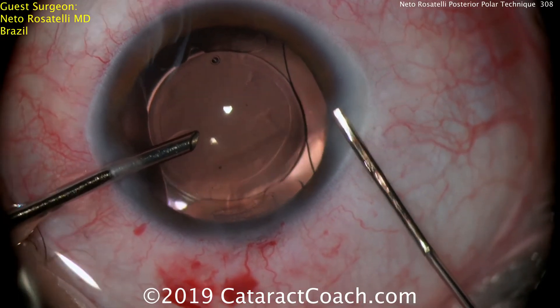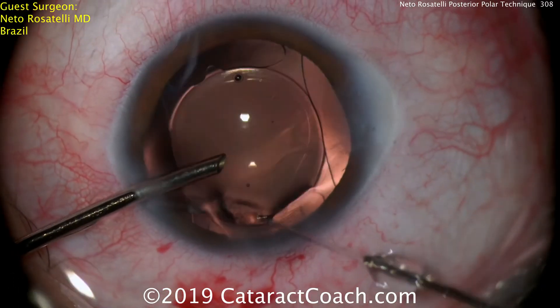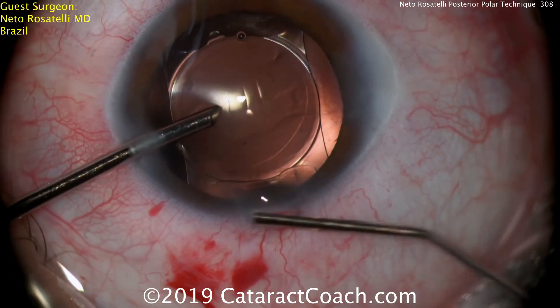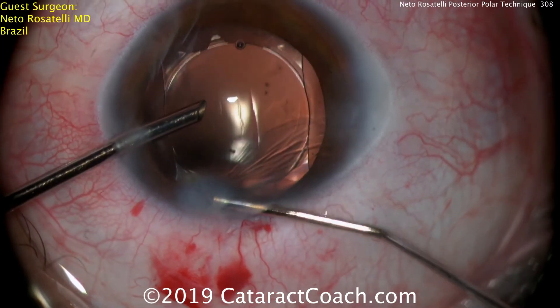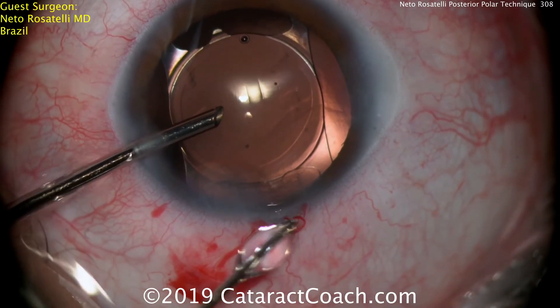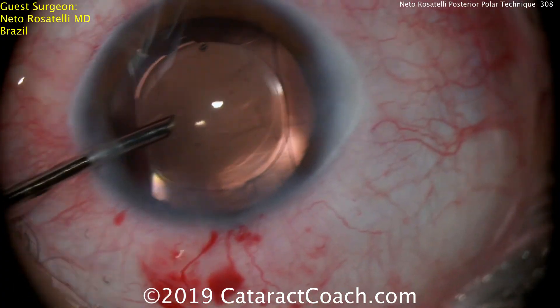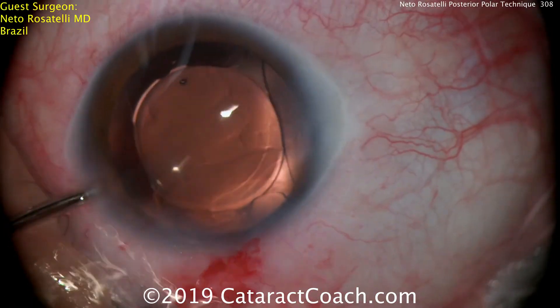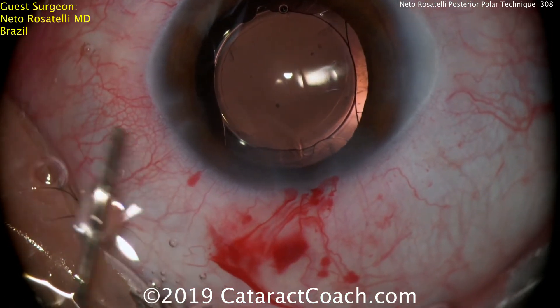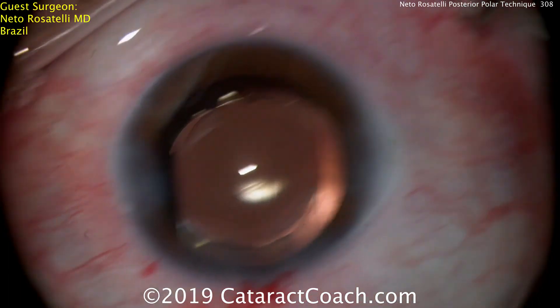Now the left hand is holding infusion in the eye while the right hand is hydrating and sealing the incisions. Again, important — do not let the anterior chamber collapse. At this point, at the end of the case, we don't want to instill more viscoelastic. So just using the left hand with the infusion on constant irrigation, he's able to keep the eye inflated — even at the very end, no deflating of the anterior chamber.